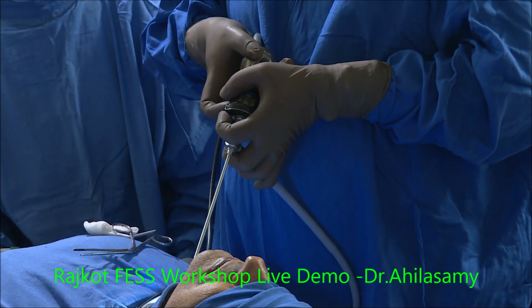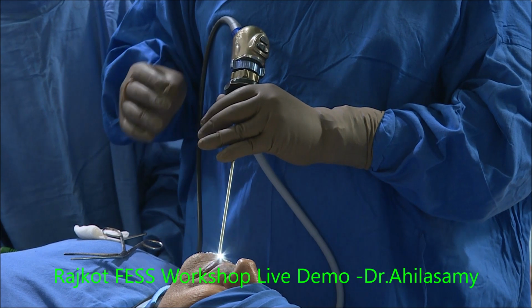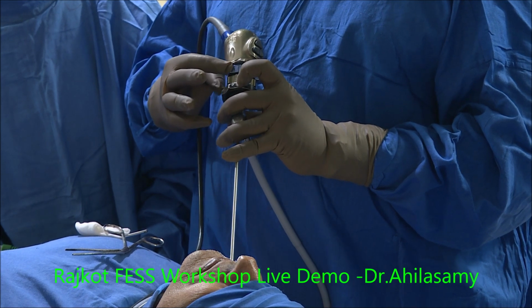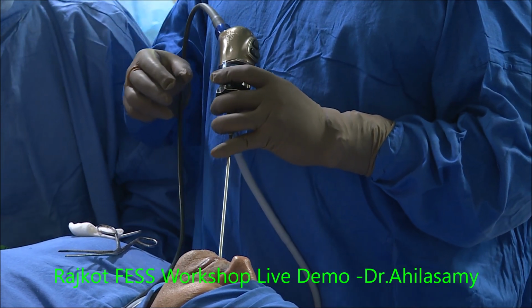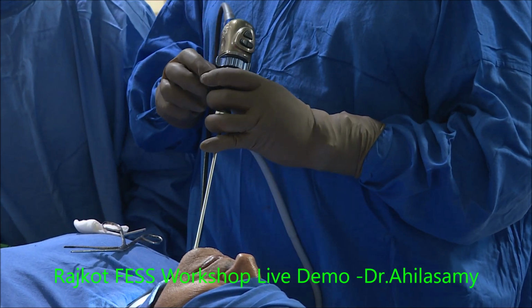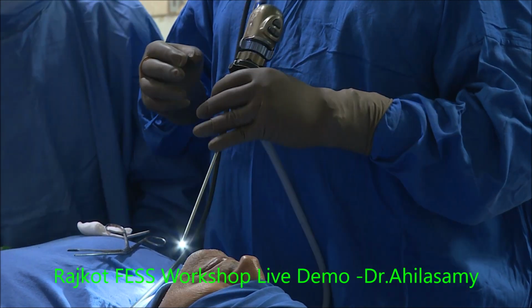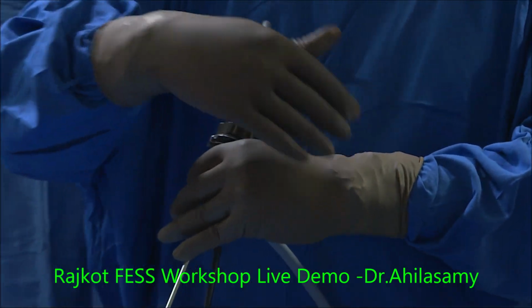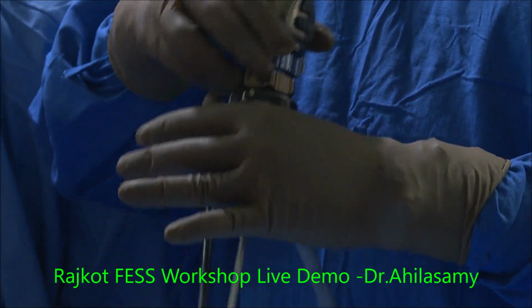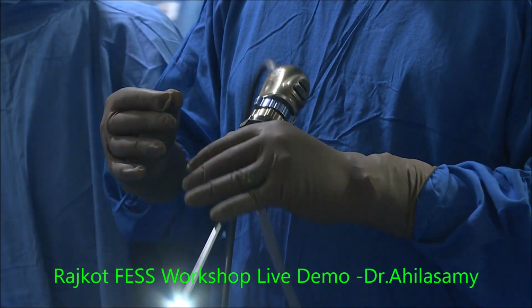But my way of teaching is this way. It is to be held like a flute, and I don't touch these two parts. One is the zoom, and the other is the focus. When some people touch them, when it is loose, the focus and zoom keep changing. And some when they hold it here, it keeps changing and the camera tilt occurs. So I always hold it here and show the wrist. It should be very like a flute, so that there will not be pressure on the hand and fingers.